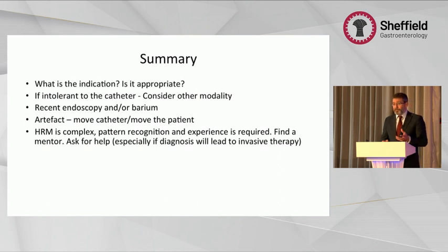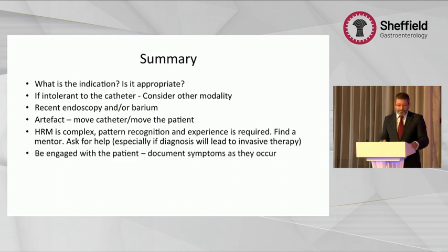And high-resolution manometry is complex. It requires pattern recognition. Those of you who do physiology, find a mentor, ask questions. We're a small community. There's nothing wrong with sending an email to your local friendly physiologist and asking, what do you think of this? Do you think this is a good idea? Most folk will be more than happy to answer.